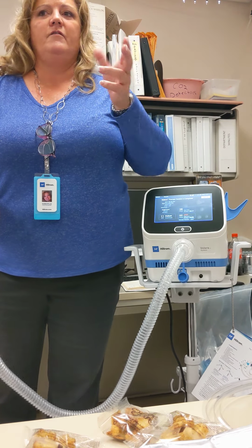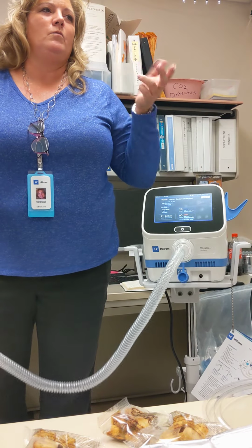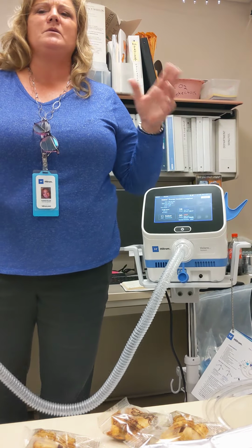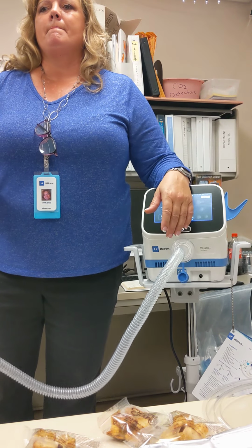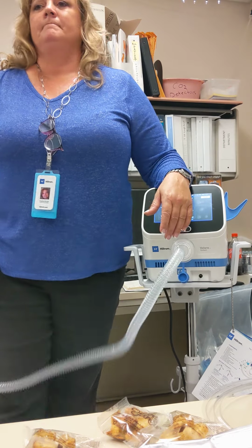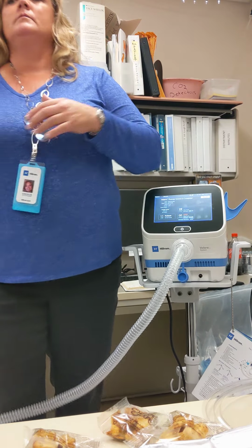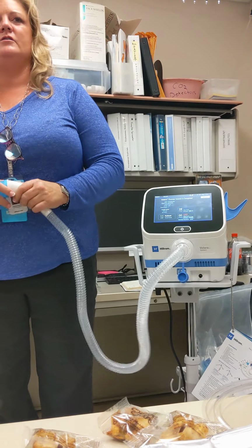If you change that on the vent, then you get more precision. Then the vent won't be wondering, is this person breathing? What's going on here? When am I getting double breaths? That's why you suggest pressure mode ventilation for therapy, not volume. Correct. If we're in volume prior, we switch to pressure, then go back to volume after therapy. Absolutely.